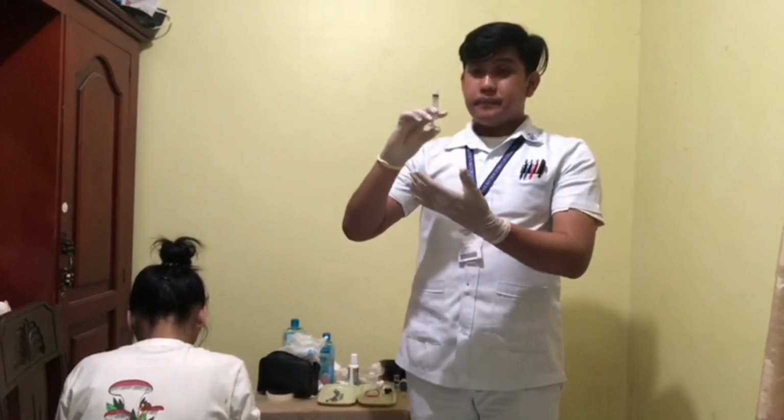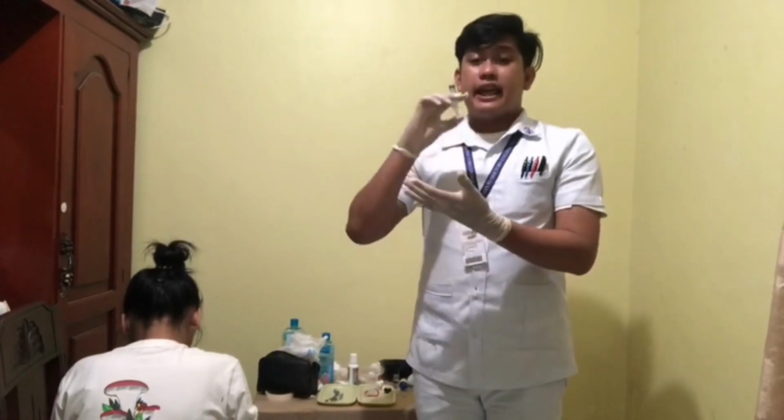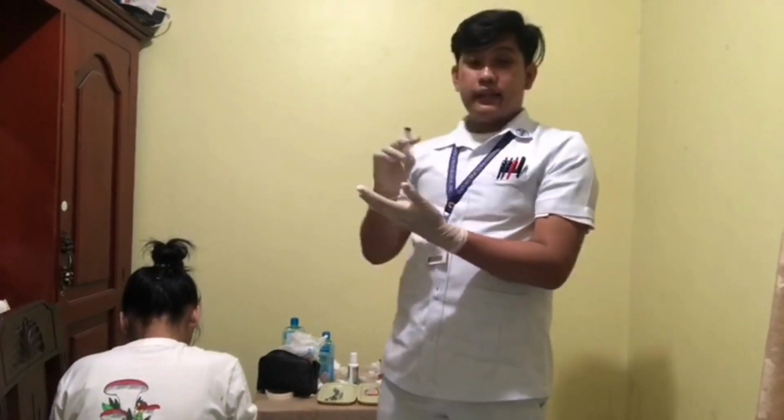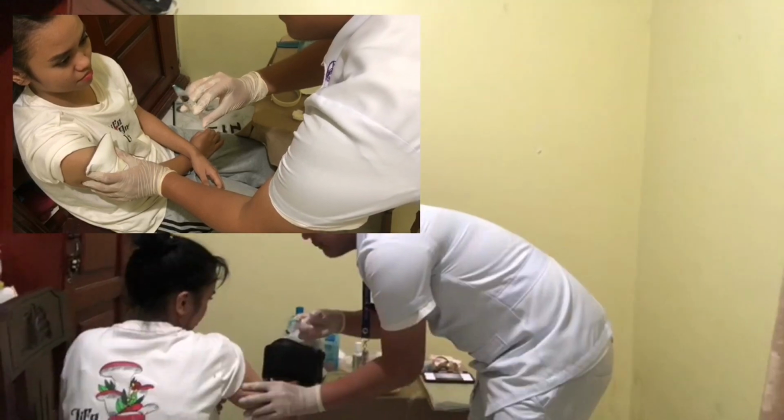Then we'll hold the syringe between the thumb and the four fingers, as if you are holding a pen. So piercing the skin quickly and smoothly at an angle of 90 degrees. So now, while I am going to position.